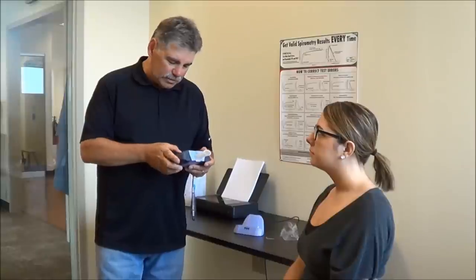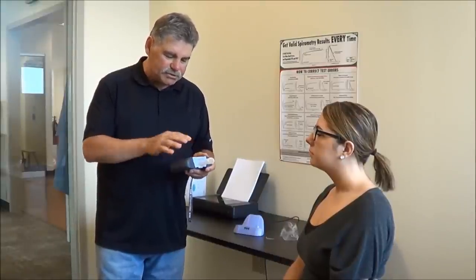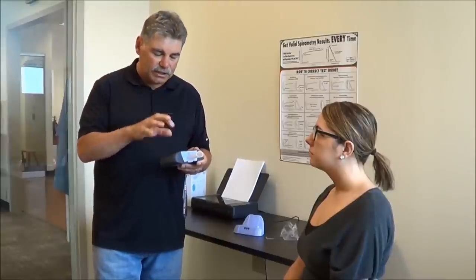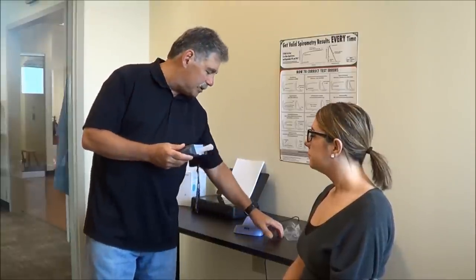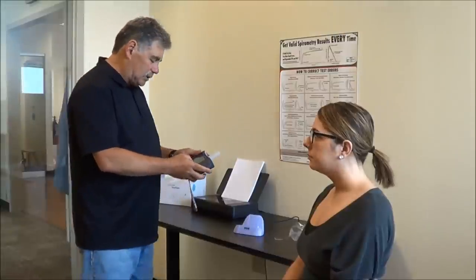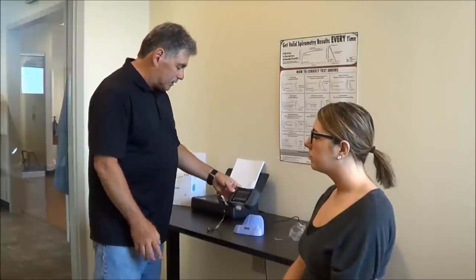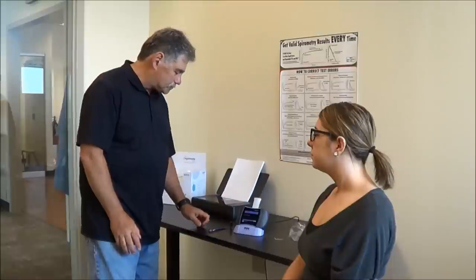So I'm going to hit end test. And I have screens here where I can tap around and I can blow up the curves and look at them. I can look at the data more carefully. But in this case, I'm all set up here with a printer. So I'm just going to hit print and have the test print directly to this printer.